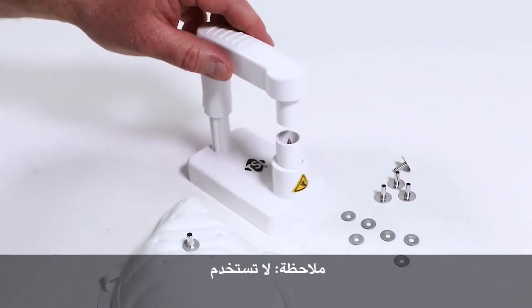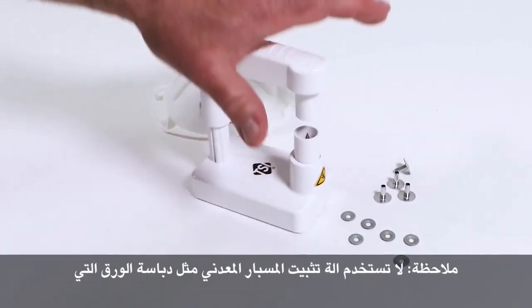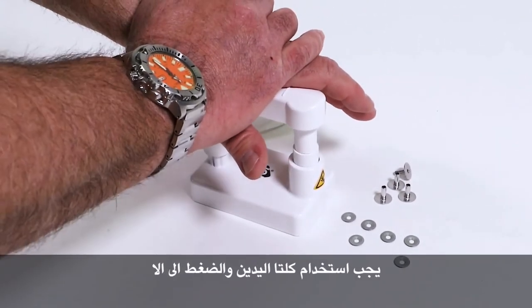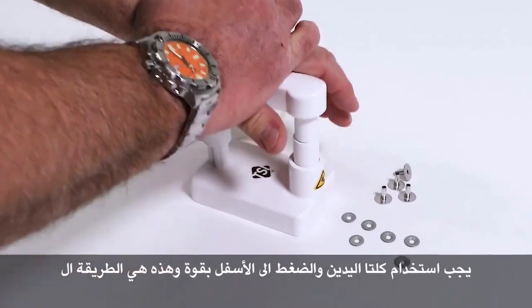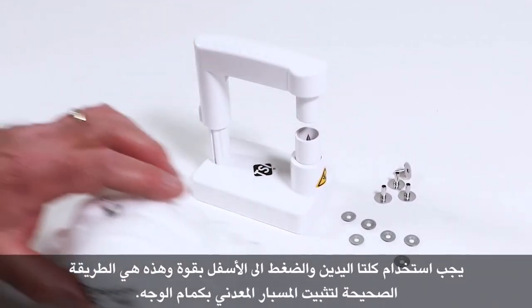Note: do not use the Porta Punch like a stapler where you're just quickly pushing down. You need to use both hands and push down with force to go all the way to the end. And that is the proper way to use the Porta Punch.